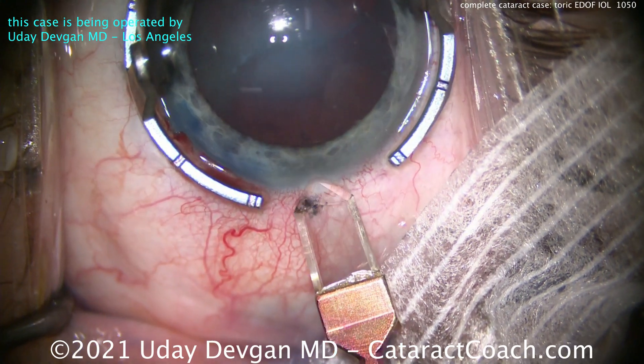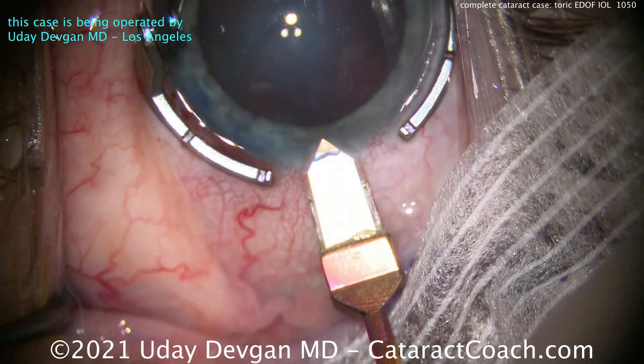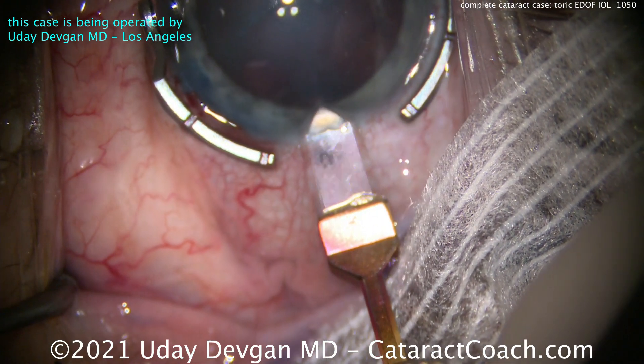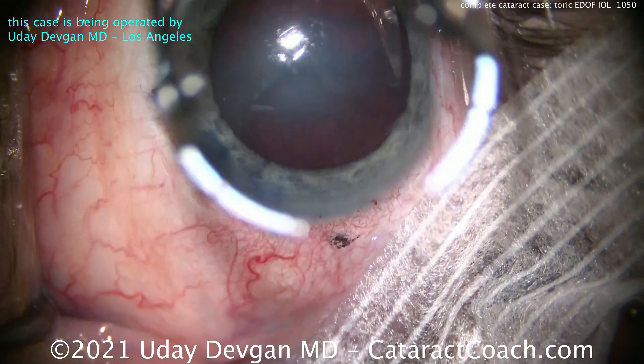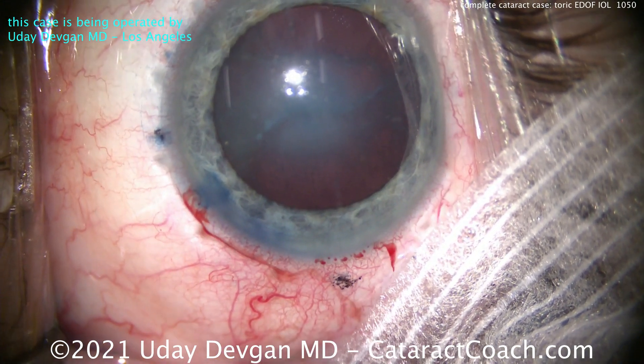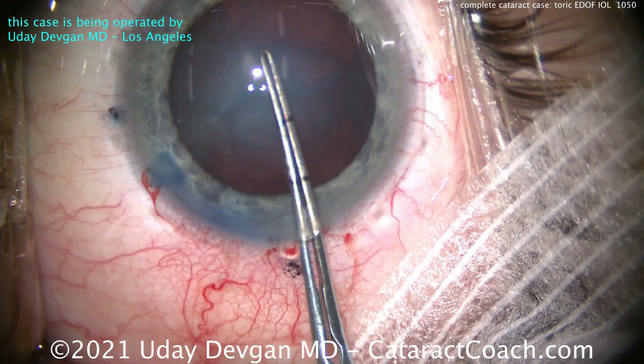Here's the diamond keratome being used to create a self-sealing temporal incision, getting the architecture just right — that looks perfect. We're making that incision on the steep axis of astigmatism. The patient has against-the-rule astigmatism with a steep axis of just about 10 degrees.